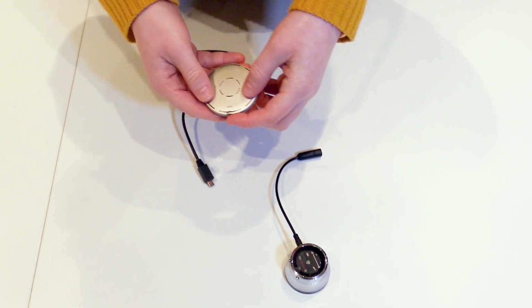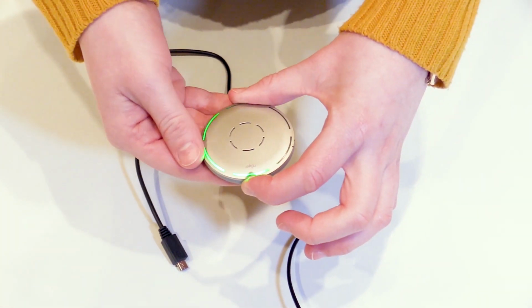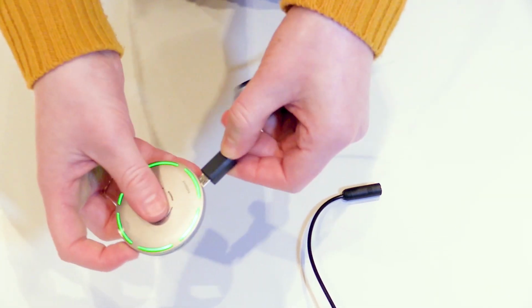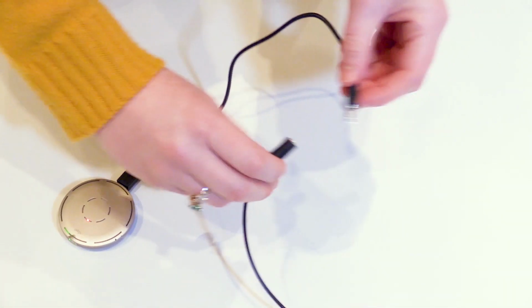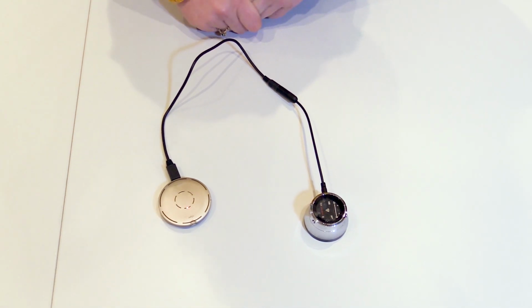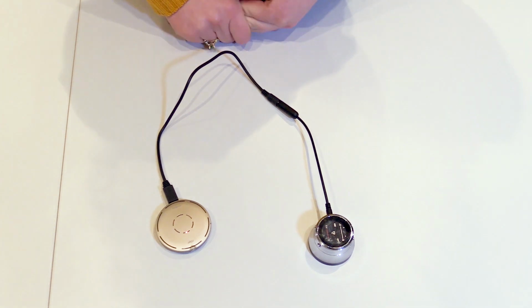And then we just make sure that before you connect it to the stethoscope, the Roger microphone is paired to the hearing aids. After it is connected to the hearing aids, we plug in the appropriate cable into the Select, and then again into the stethoscope. And now the stethoscope is configured to stream auscultation signals from the stethoscope to the hearing aids via Roger.